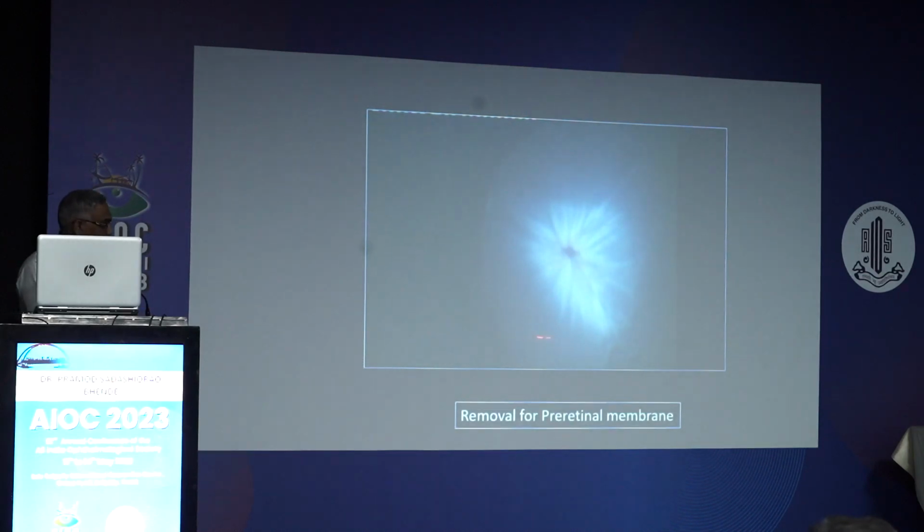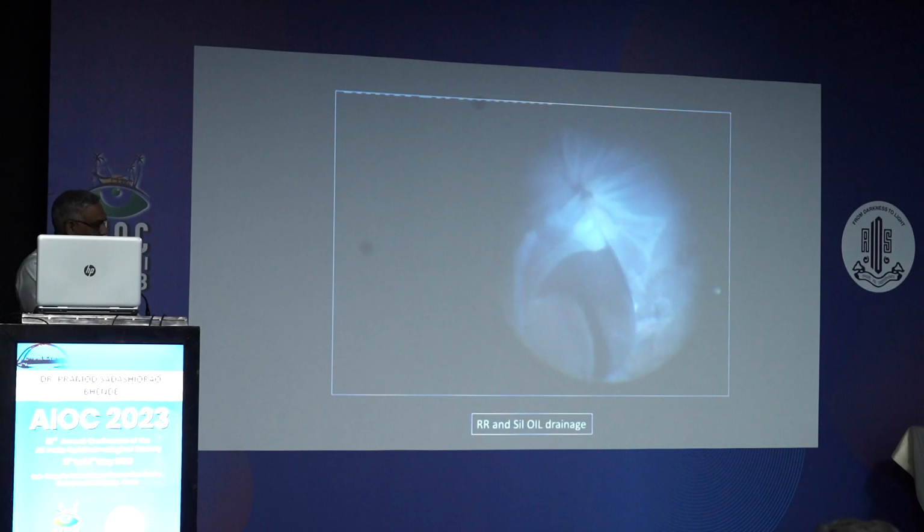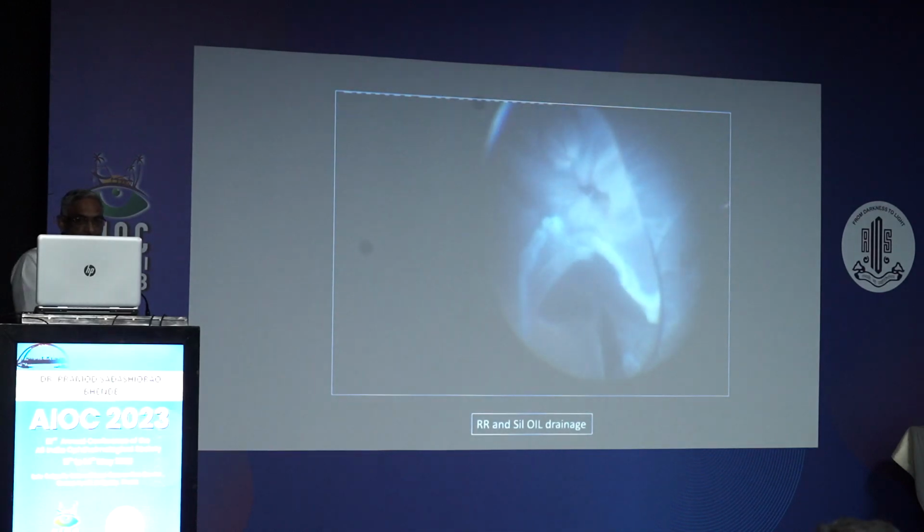When you do subretinal oil removal, generally you try with a small, tiny retinotomy, but sometimes because of its surface tension, it doesn't come out that way. Because of the way we see it, at the 12 o'clock area we tilt the globe down a little bit, so it makes sense to make a superior retinotomy rather than an inferior one. Most of the time through an inferior one, it doesn't come out at all. There was a break here, so we enlarged that break. Initially I tried to nudge it a little bit, like delivering a baby, and it stretched itself, but it still needed a much larger break. It squeezed itself out and then flowed freely, as you see the reflex coming up, and I am still using active suction here. That's why partly it's coming out, and then the whole thing is stitched.